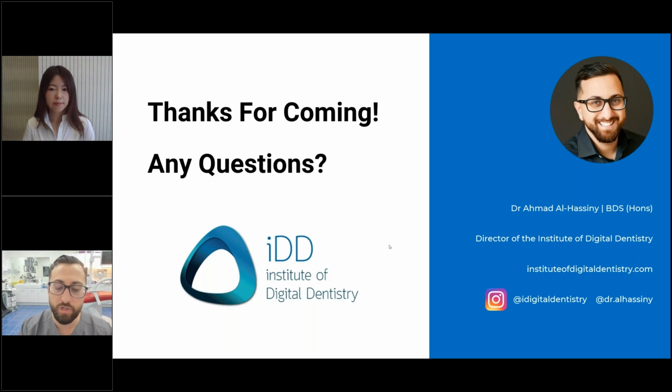And like I say, if you want to go even further than that, I would explore the jaw motion tracking devices that exist on the market. But there are definitely multiple ways of capturing a patient's jaw motion and their bite. And it's just a matter of understanding the software within the Medit platform, within Medit Link, and how to use this.